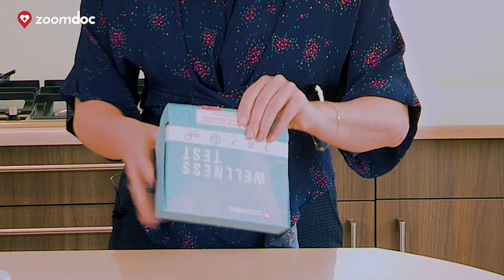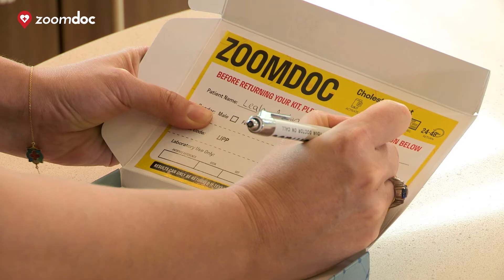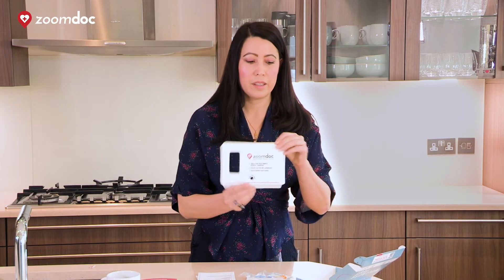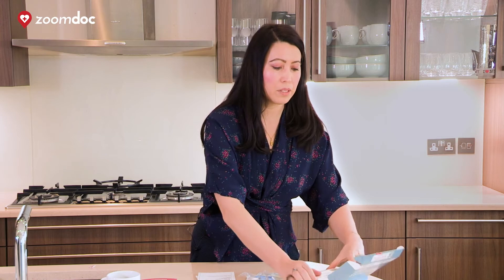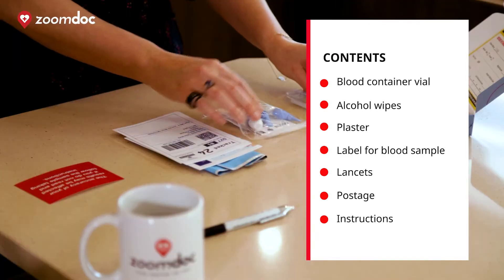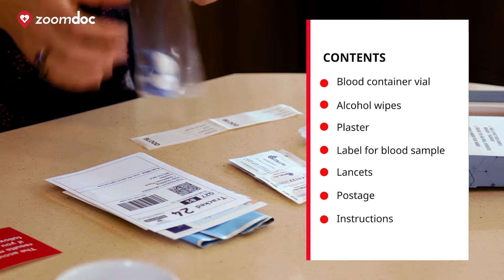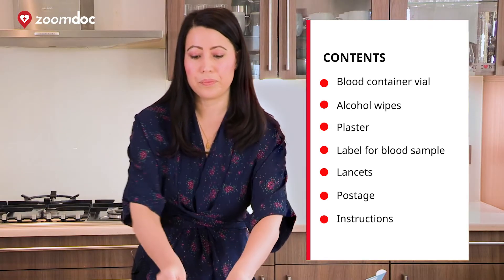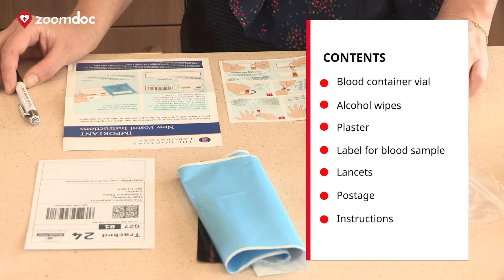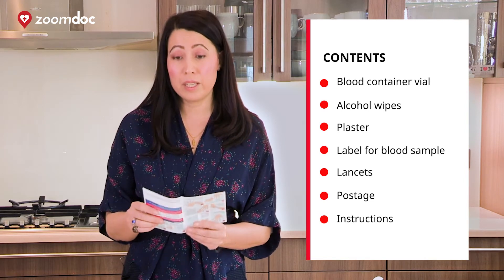I'm going to open the test kit. On the inside cover is a form that you can fill out — please complete this. Take it all out. I'm going to put this cover back in the box as it will be handy when we do the blood test. So we've got a vial, some alcohol wipes and a plaster, a label for your blood sample to stick on the vial when we're ready, some lancets, and postage. We have two instructions — one is for how to post the sample and the other for how to take the test, which we're going to go through, but please read this as well.